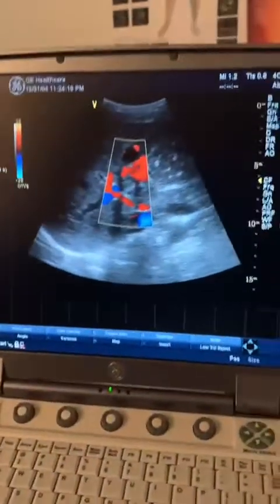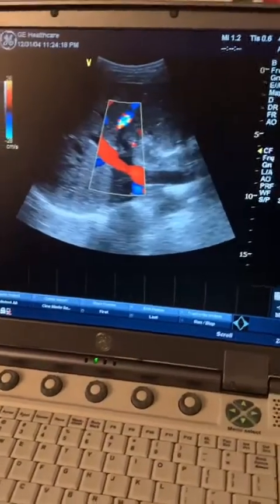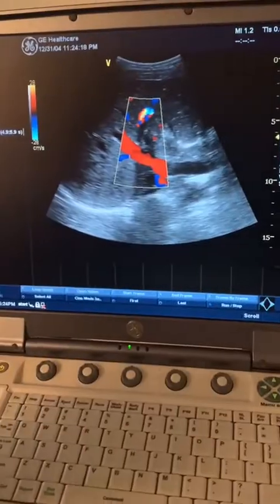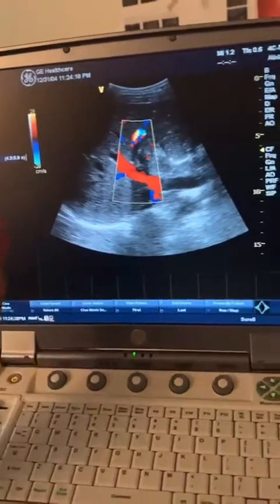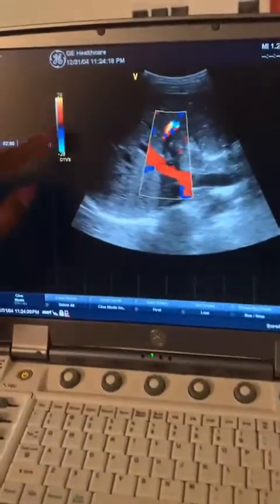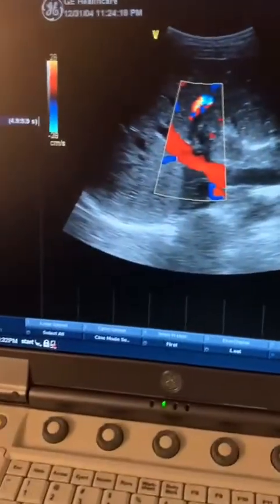So the approach I'm going to use is to go in between the ribs. When I go intercostal, you can see right on that screen that the portal vein, which looked like it was draining the liver with a negative doppler shift, is actually showing a positive doppler shift with blood flow going into the liver. You can see the red and the blue on the side of your screen — a positive doppler shift.